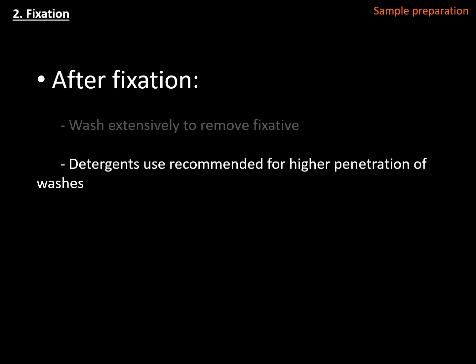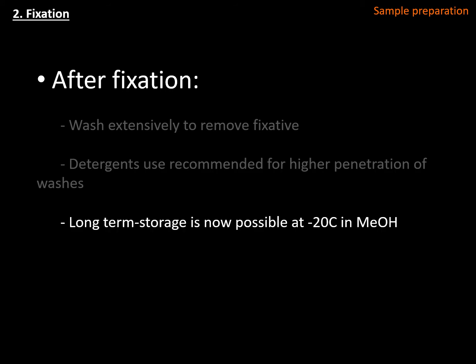It's also very good to use detergents during the washings after fixation, because they promote a higher penetration of the washing solution, allowing a better removal of the reagents inside. And then, after washing, long-term storage is possible. This is normally carried out at -20 in methanol. And methanol has very good advantages.